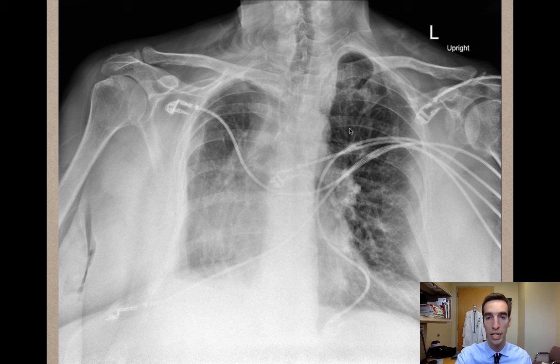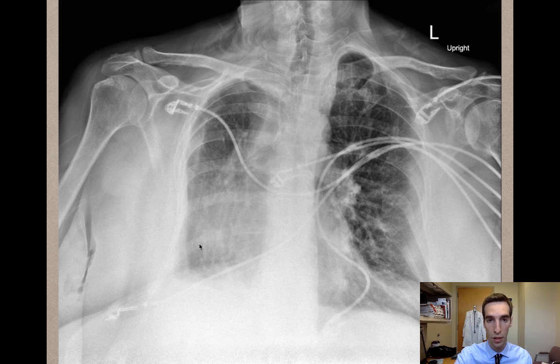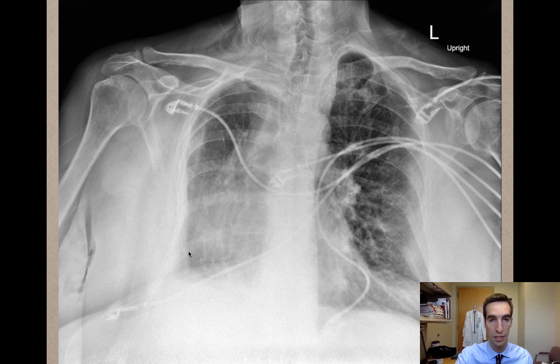Looking next at the heart — the C is the cardiac part of the mnemonic. You're trying to look for a smooth cardiac silhouette. Typically, the heart is pointing to the left side of the chest, but in this case, the heart is pointing to the right side of the chest.